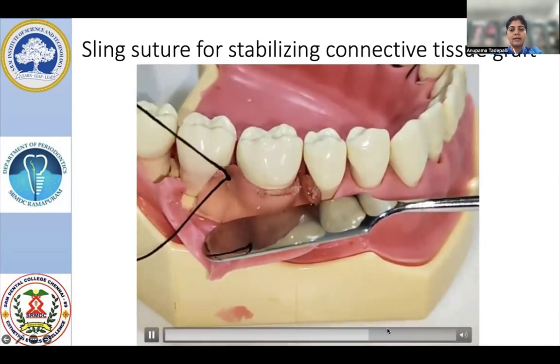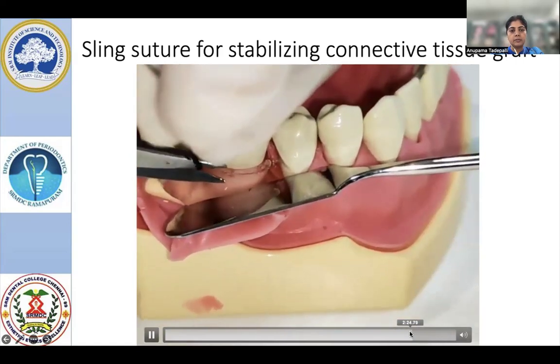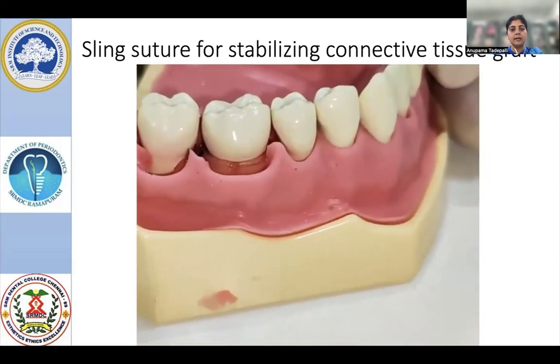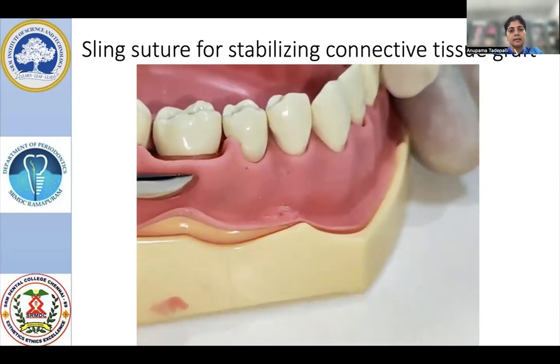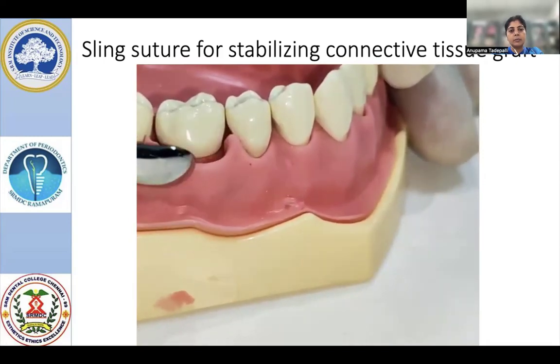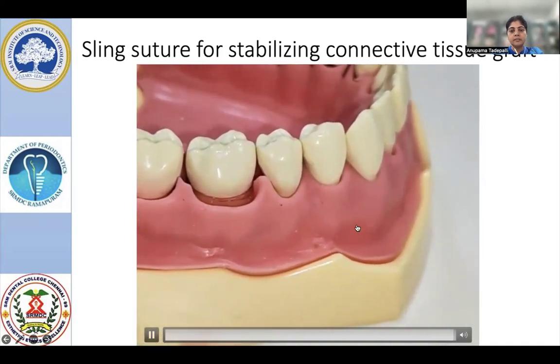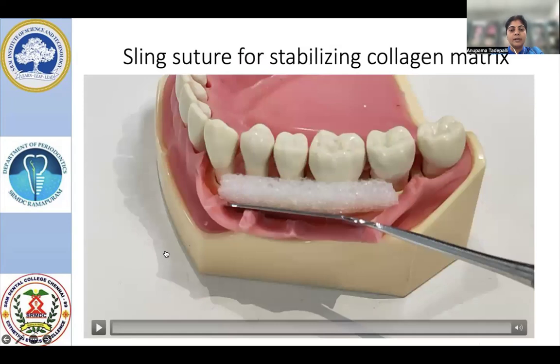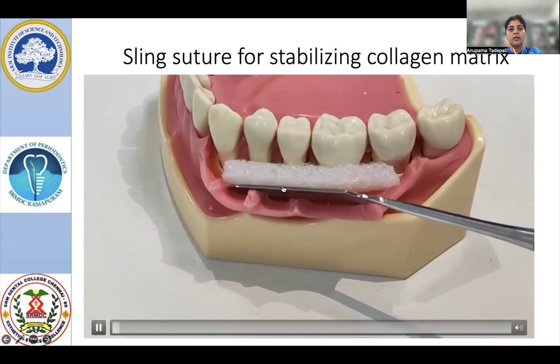This shows our adaptation of connective tissue graft onto the prepared root surface. Once you finish the knot, you will be trimming the excess suture material — 2 to 3 mm will be adequate. Once you finish that, you will see the superficial flap, whether it is adequately covering your connective tissue or collagen matrix, and then proceed for suturing of the superficial flap. That concludes the connective tissue grafting portion.